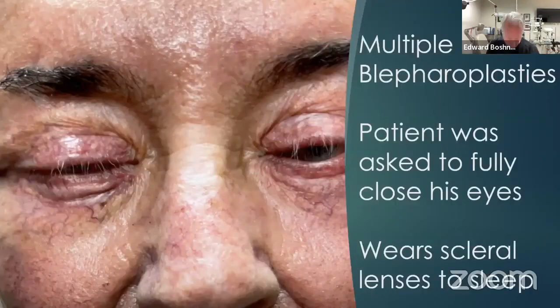This is a patient that had multiple blepharoplasties. He's a performer and didn't want wrinkles under his eye. It turns out that after multiple eyelid surgeries, he can't close his eye. And we asked this patient, close your eyes as tight as you can. And that's what you're seeing over there.